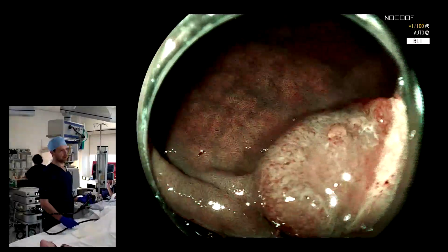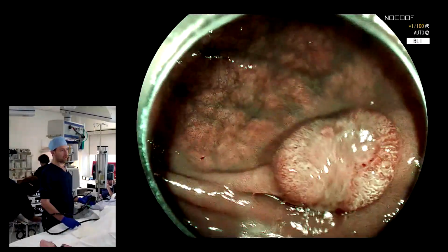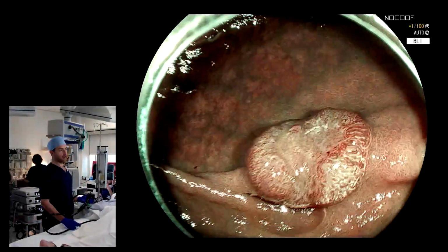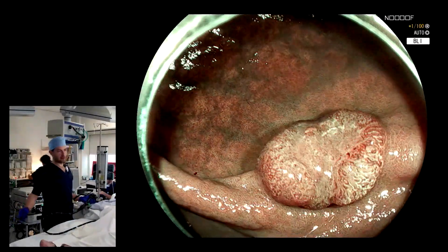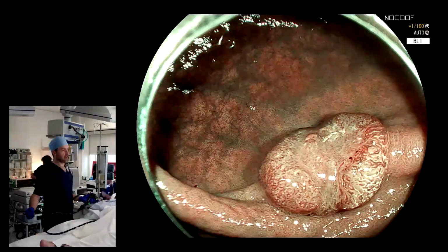So at that point, we want to remove it with a technique which is going to give us proper depth assessment. And I think in this case, it would be quite difficult to remove this with ESD. Definitely not impossible. You can also see that fold is a little deformed there. But a much better approach would be to remove it with full thickness. So let's take the marking probe to start marking this for full thickness. And we'll show you the technique of removing this lesion en bloc.